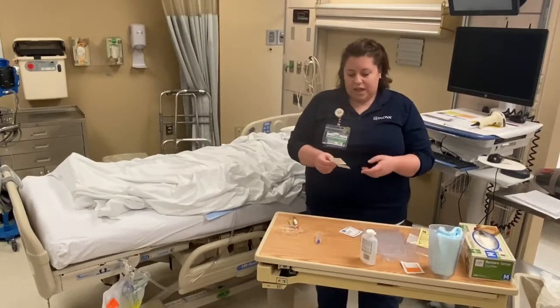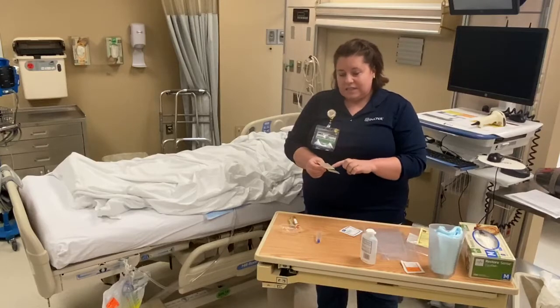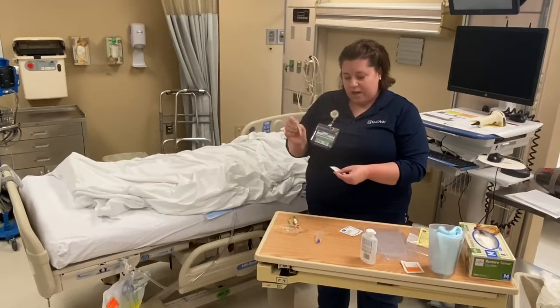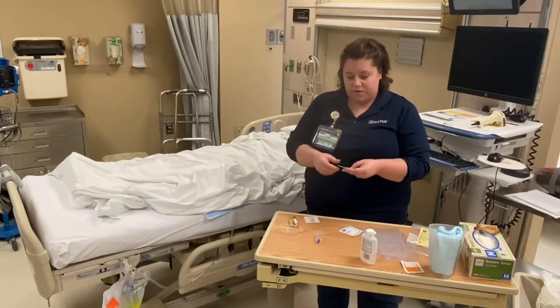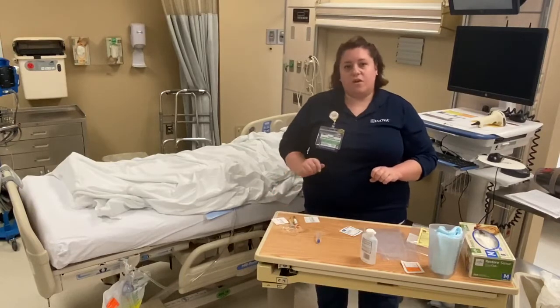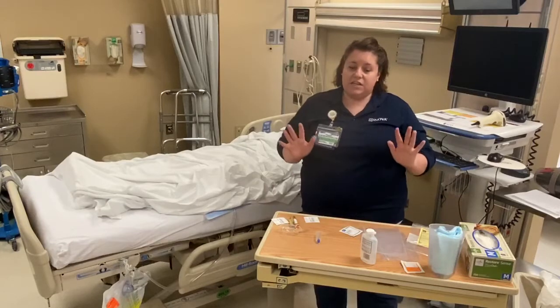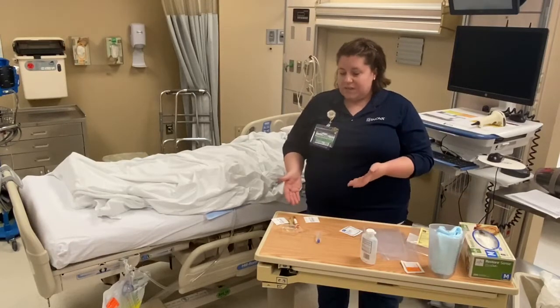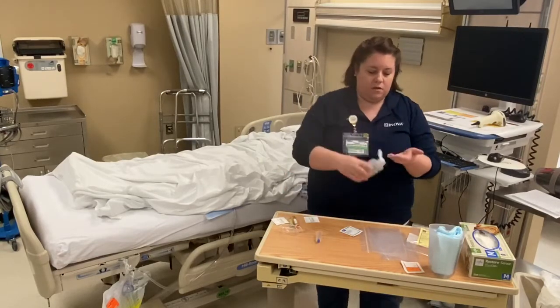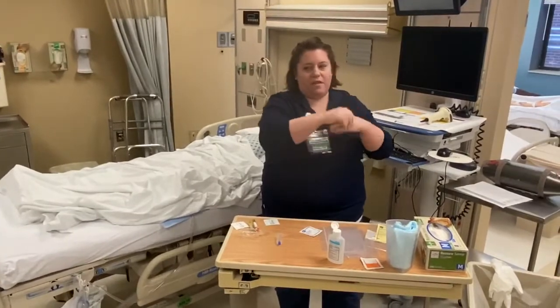When I get ready to label, I also am going to look at the bottom of my labels because it lists the test name. So I have urinalysis, yellow and red, that I'm going to make sure goes on the yellow and red tube. And I have the urine culture, which says gray, which I'm going to make sure goes on the gray tube. So now that I'm ready to label my tubes, I actually need to put my gloves back on because I'm potentially coming in contact with body fluids when I pick up my tubes. So I'm going to wash my hands here and put my gloves back on.